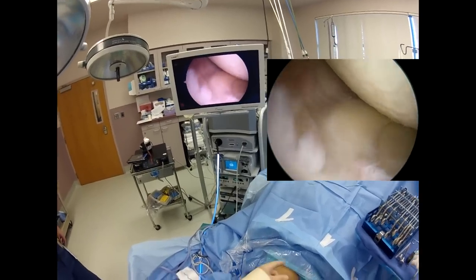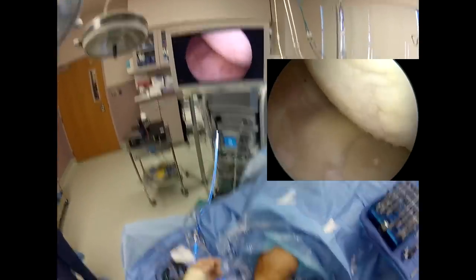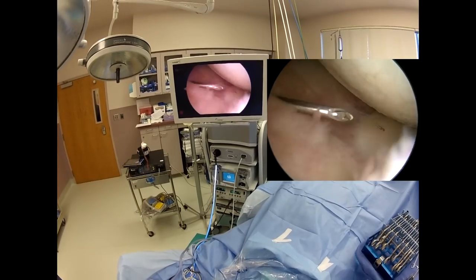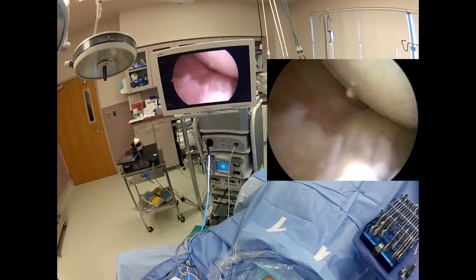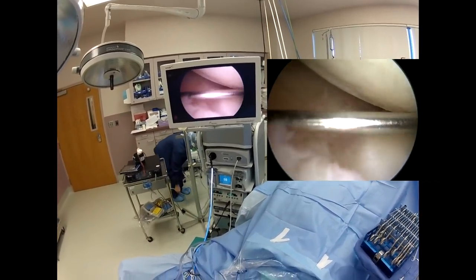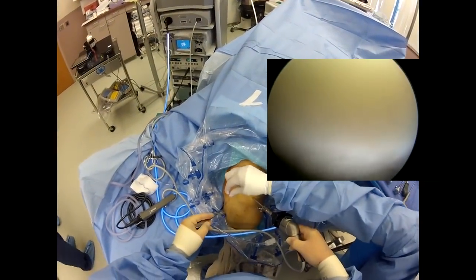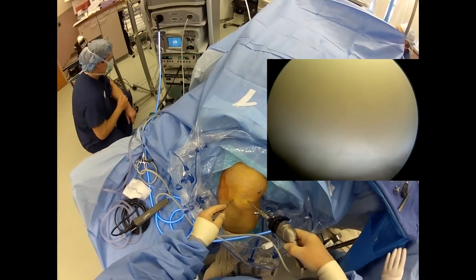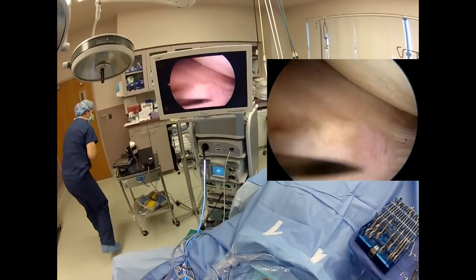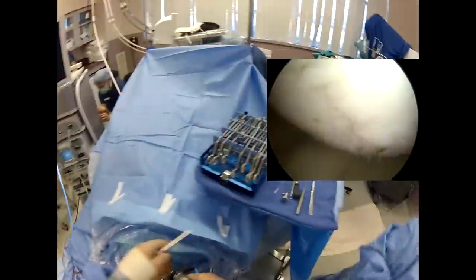I'm going to make the medial portal right now. Hand me an 18-gauge needle. You can see where I started on the skin, then we come in. We make sure we're above the meniscus up here, then I make sure I can get in deep with my needle like that. Go ahead and pull the needle out. Just watch the knife go in — make a little bit of a capsule cut there. Makes it easier to get your probe and shaver.